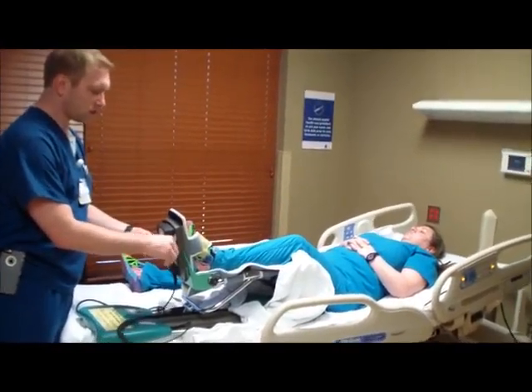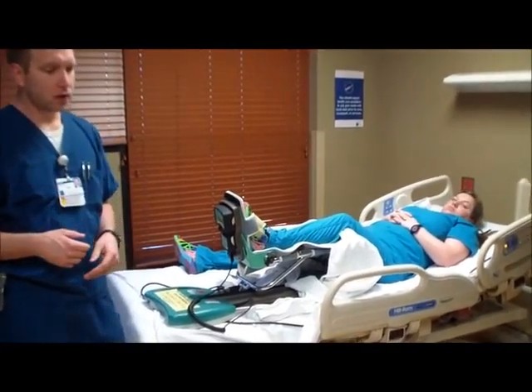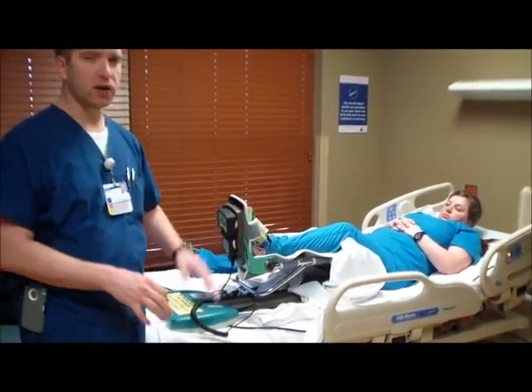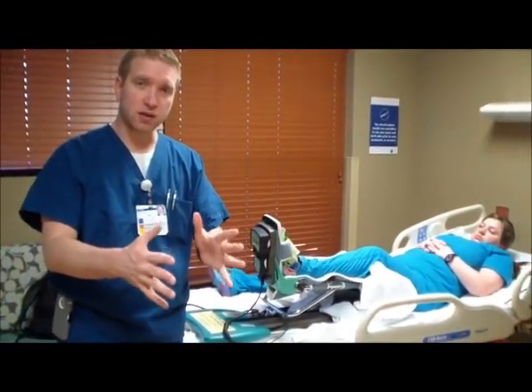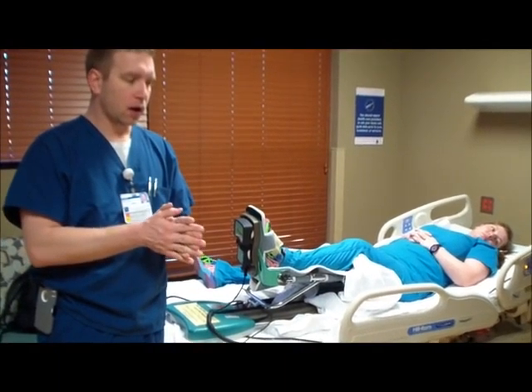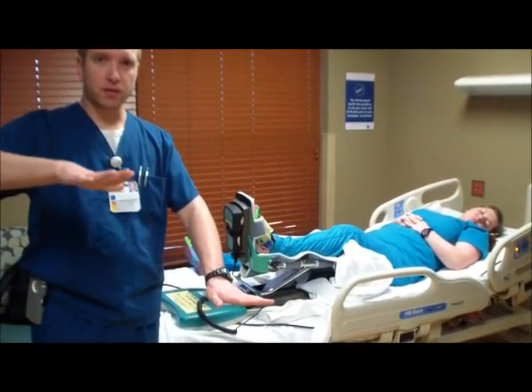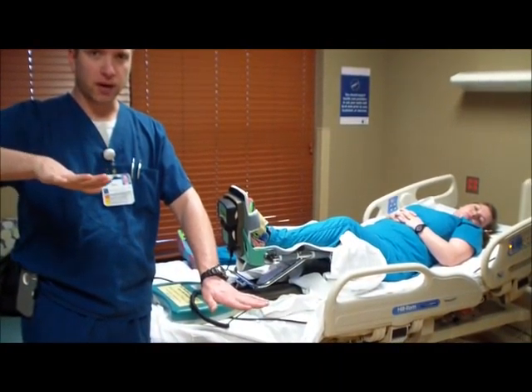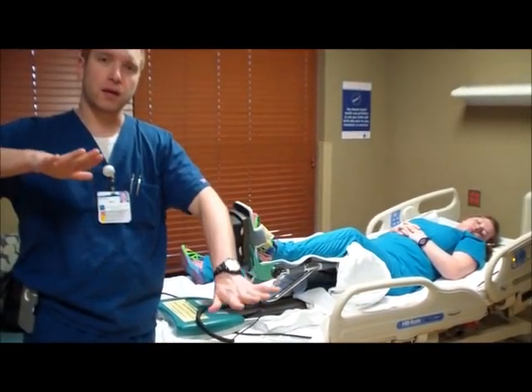There's also situations where we have a bilateral total knee replacement that has been performed. In that position, you're going to have one CPM on each side. Typically, you'll have to bring their legs out a little bit more to allow for the space needed for those devices. When you turn those on, you're going to bring one up at a time. Once that one gets all the way up, you're going to allow that one to start coming back down. You're going to turn the other one on. So it's what we call kind of a running man.